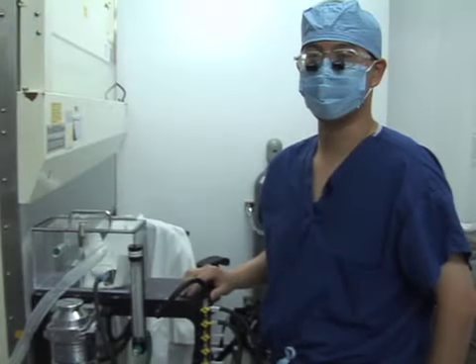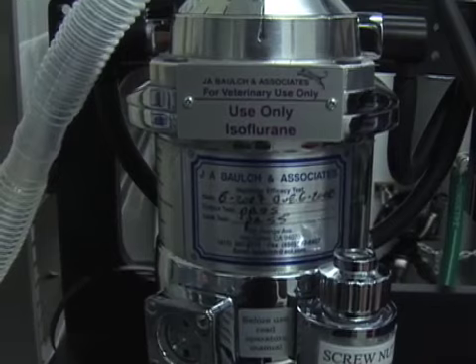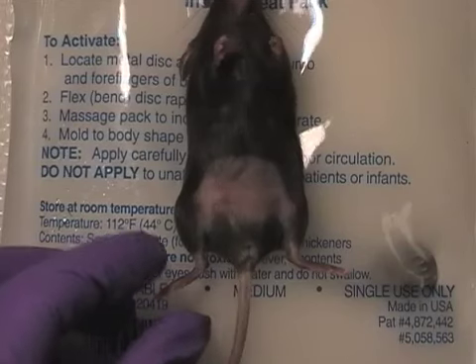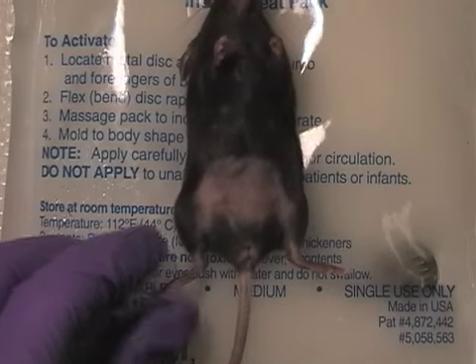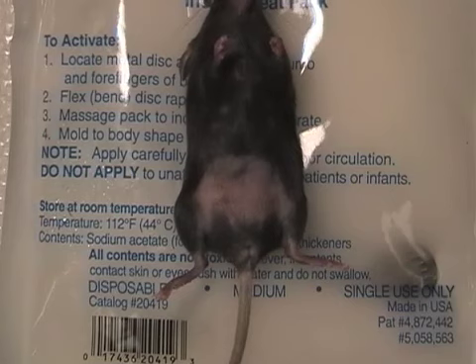In our laboratory, we use an inhaled anesthetic, isoflurane. Alternatively, one can use injectable anesthetics to achieve the same effect. The depth of anesthesia is assessed using toe pinch. There should not be a withdrawal reflex upon toe pinch. Antibiotics may be given at this point.